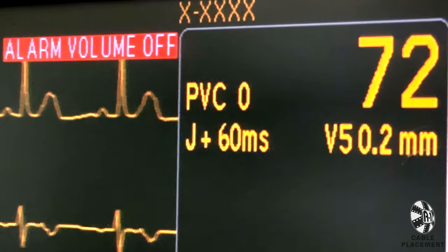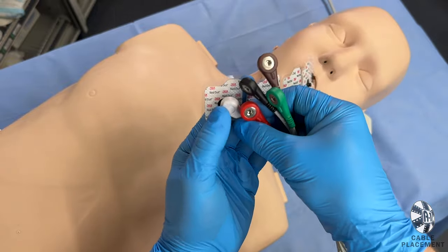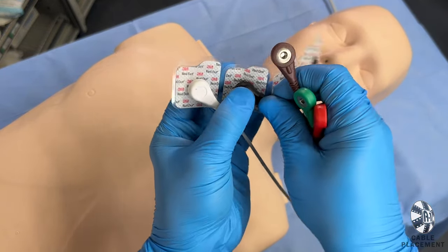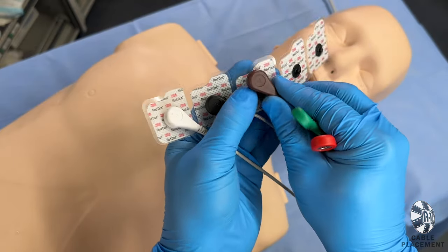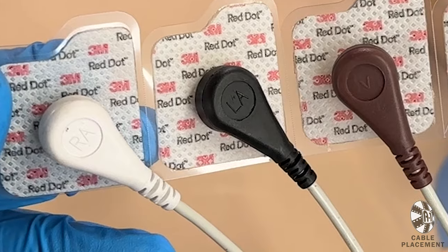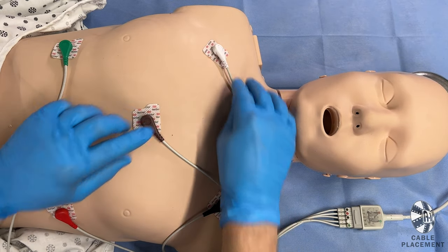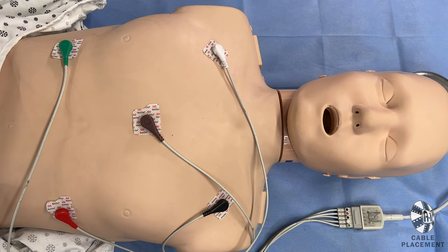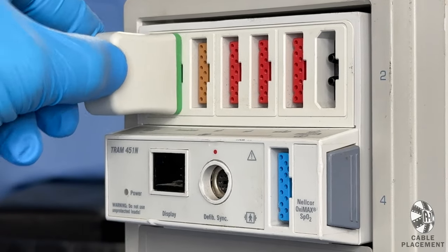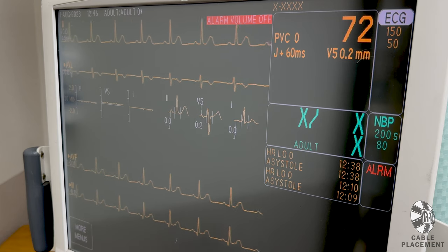To hook up the patient to display a live reading for ECG, snap the 5-lead ECG cables to the included electrode stickers. They are labeled to help you place each wire in the general area. Place each lead wire on your patient's chest in this X configuration. Plug the green end of the cable into the green monitor input. The screen should now display your actor's live heart rate.